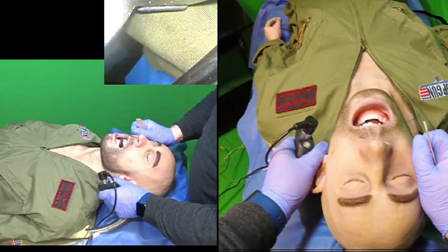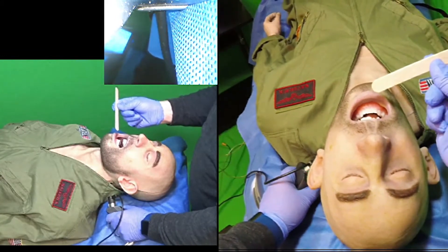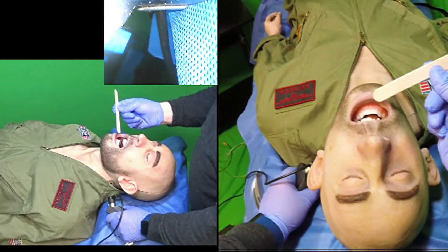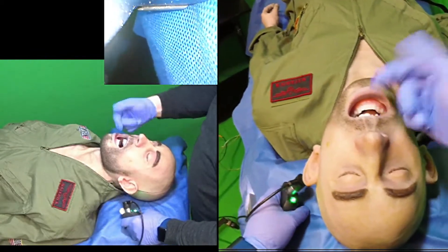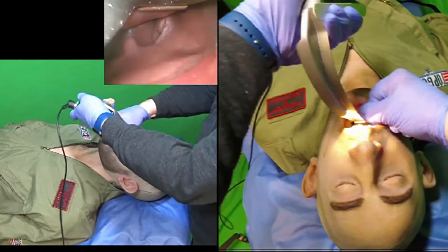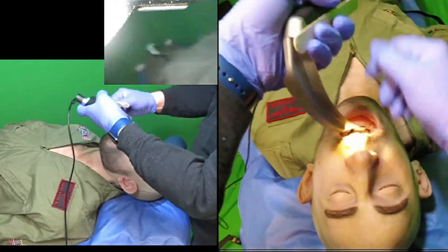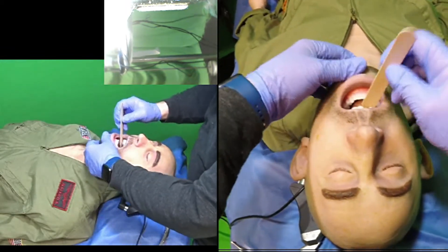Micro skill number one: insertion of a laryngoscope using the modified scissor maneuver with a tongue depressor. The standard scissor maneuver uses the thumb and forefinger to open the mouth and place the blade. What I'm showing is a modified procedure in which a tongue depressor is used instead.